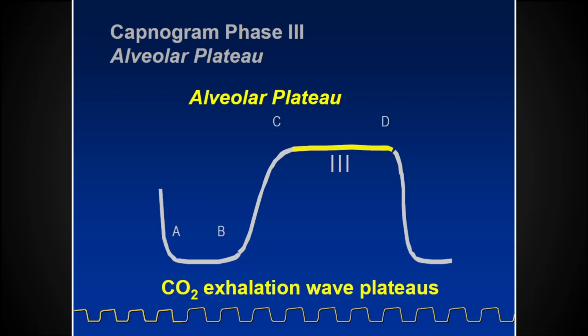I do care that you know that this is the alveolar plateau. I don't necessarily care that you know it's number 3. The reason I care about this is for 2 reasons. This is essentially where our alveoli are losing their CO2. It's the end of the phase.